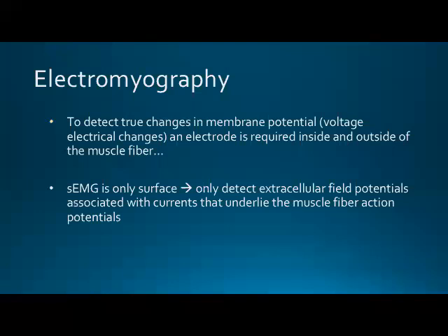So we're going to use these extracellular field potentials to then estimate the membrane potential. And based on that, we can give some kind of estimation on muscle activation or the overall stimulus that these muscle fibers are receiving from the central nervous system.